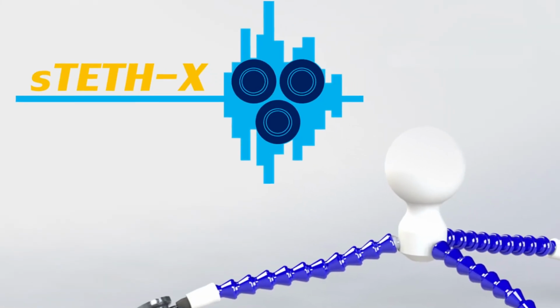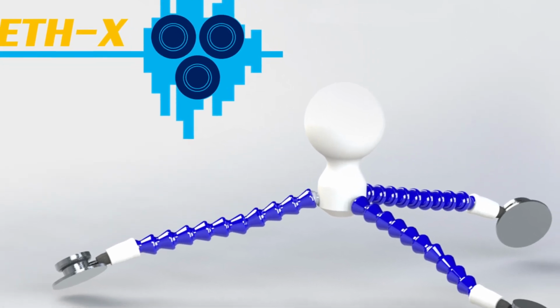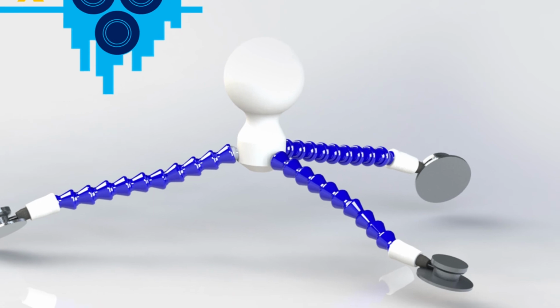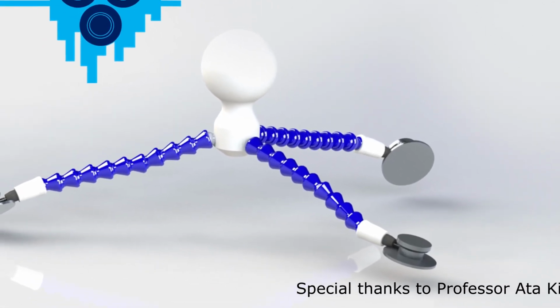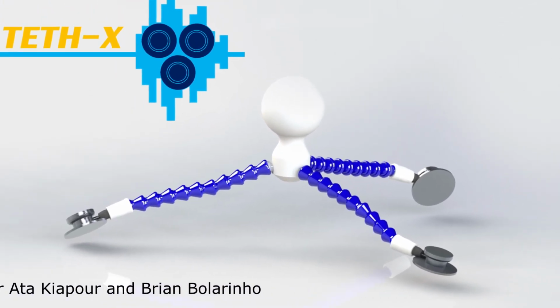With more time and resources, we believe the sTETH-X can be made into a quintessential device found in every NICU to support doctors. For example, wireless Bluetooth digital stethoscopes would increase the manageability of the device, and automated algorithmic output of tube position would remove human judgment from its intended use.